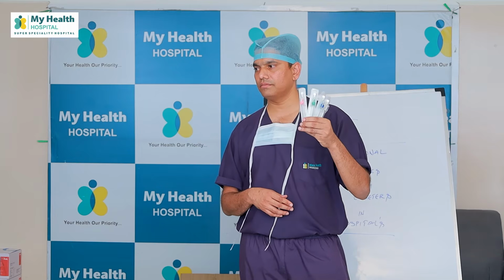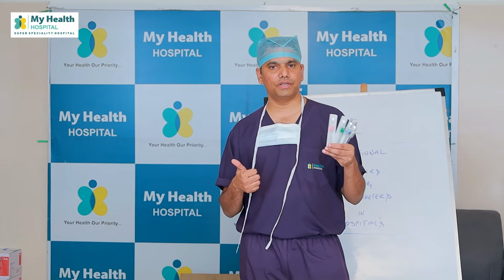What is the ideal time to change IV cannula? 72 hours, that is 3 days, or no, 5 days. Or where else will you change it?